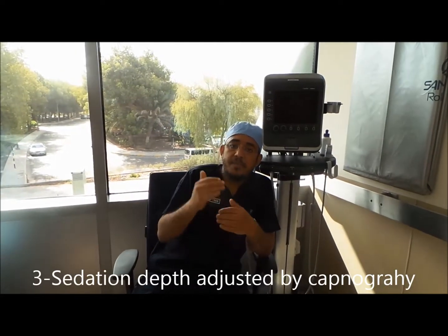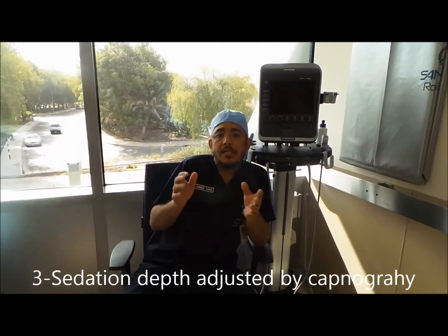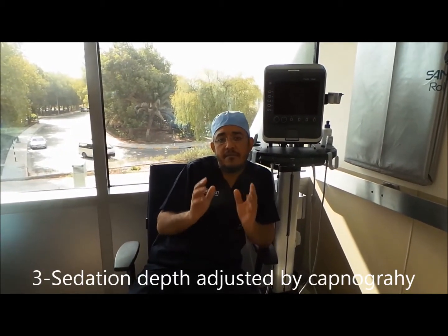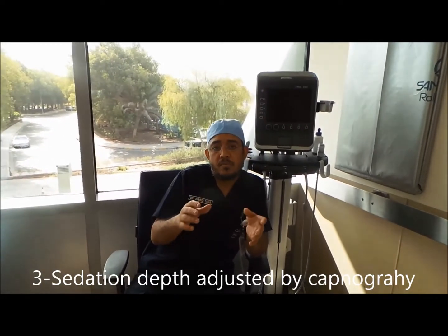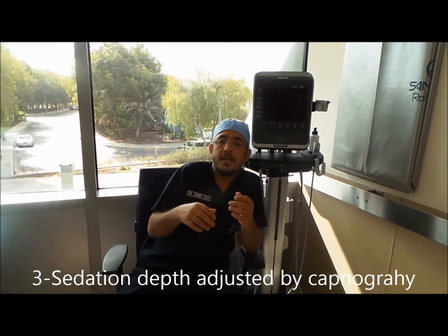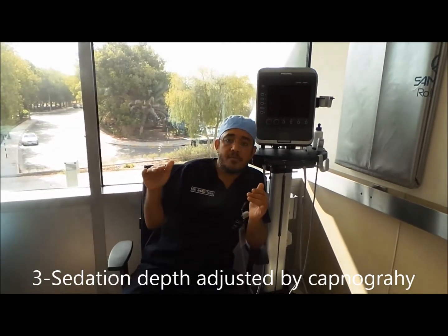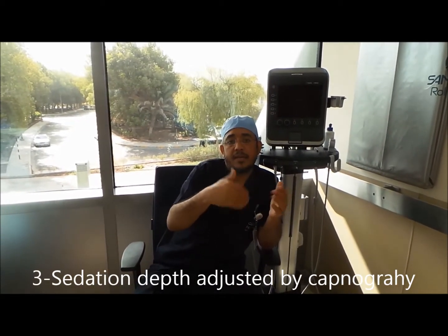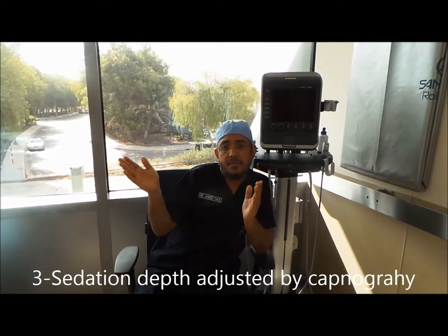We sedate the patient and monitor that level of breathing rate. CO2 sampling under the oxygen mask is a very important point. You will infuse your medication, which is mostly propofol — sometimes I prefer to add remifentanil infusion as well. In this way, we monitor the patient's breathing by the capnogram and tailor our infusion rate by increasing or decreasing it according to the breathing rate.